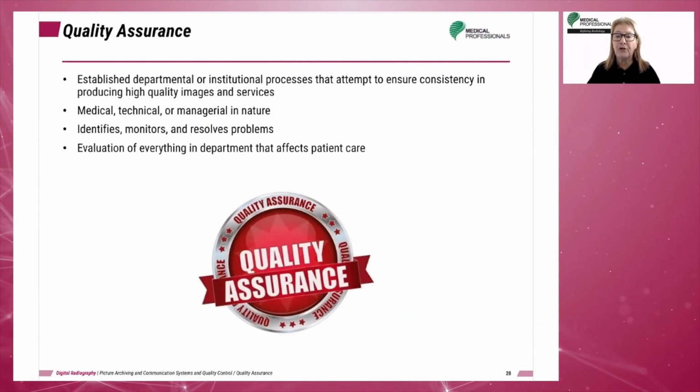Quality assurance, or QA, activities in a healthcare facility attempt to address everything that affects patient care, including managerial processes and procedures, image quality and technical standards, as well as the medical aspects of patient care. QA activities begin with observation of department and institution processes that impact the delivery of patient care. Those processes should periodically be assessed for the level of quality and for problems.